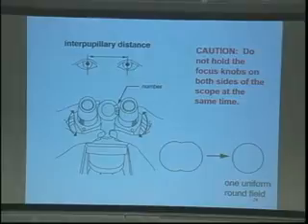Okay? The other thing is, I didn't bring my microscope because it's not real effective here, but ideally you'll have your head kind of in a plane like this and not like this, because what happens is you can rotate the entire head this way, and then you've got to hold your head like that. It's not real comfortable, so try to keep it somewhat parallel, okay? Again, you'll practice comfortability, you'll see this, okay?